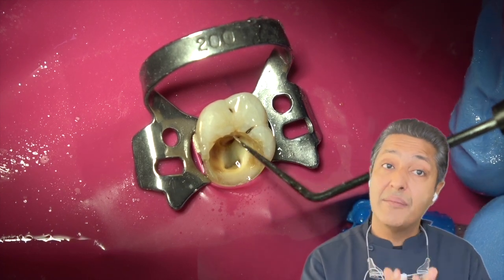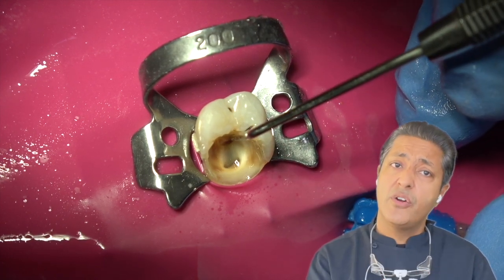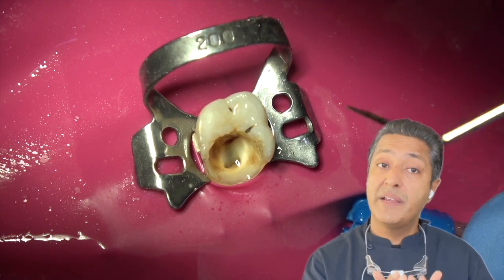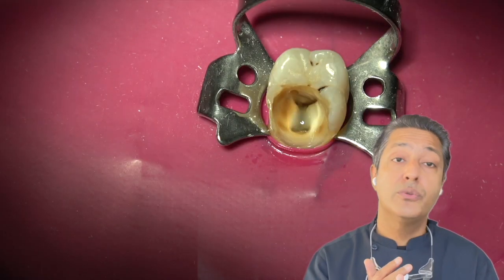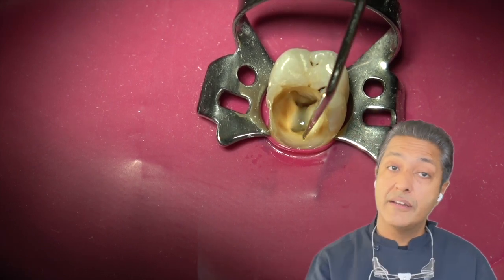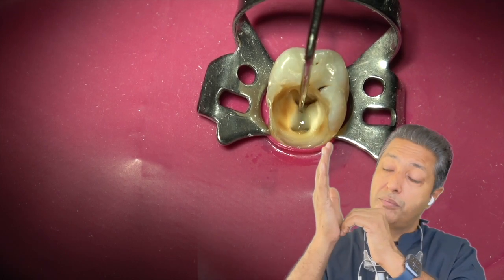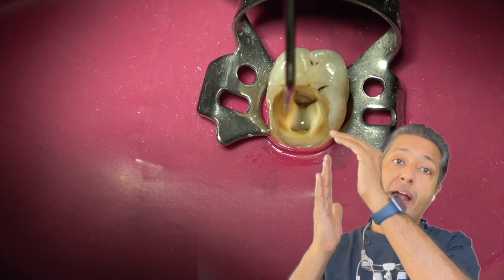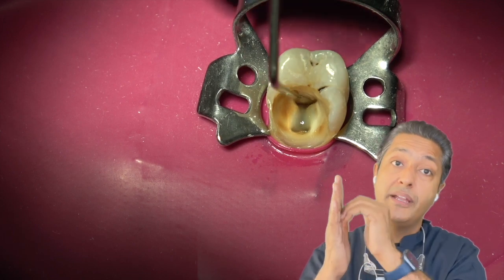So therefore, examine the axial walls of your access cavity. When we are moving our endodontic explorer from inside to outside, then our endodontic explorer should basically come out smooth. This means that the junction of the pulpal floor to the axial wall, the dentine and enamel should be in one line. Therefore, the axial wall should be smooth. So when we are moving our endodontic explorer from inside the pulp chamber to outside, everything should be smooth and our pulp chamber should be in one line. Axial wall should be in one line.